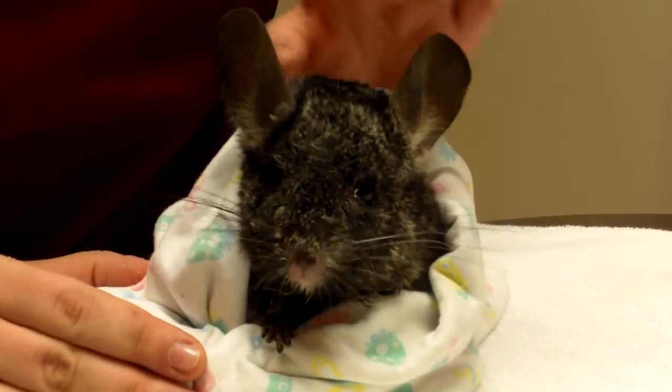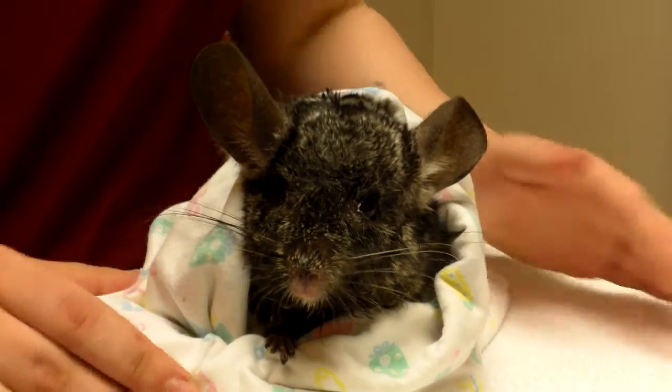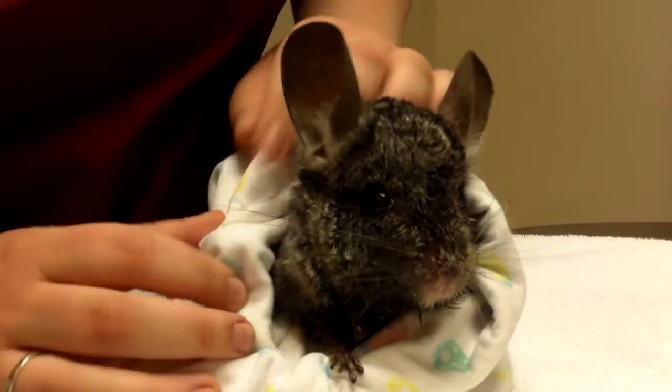Hi, I'm Brianna, one of the assistants here at the Vet Center for Birds and Exotics, and today I'm going to show you how to syringe feed our chinchilla here.